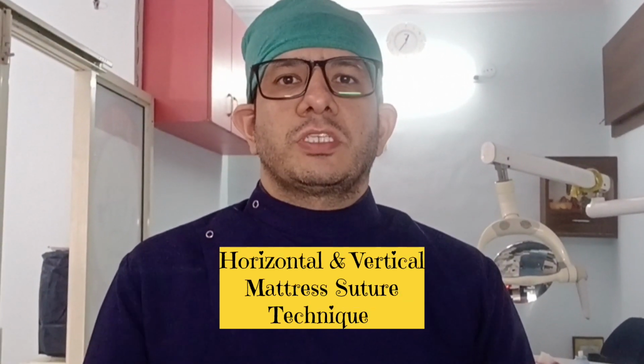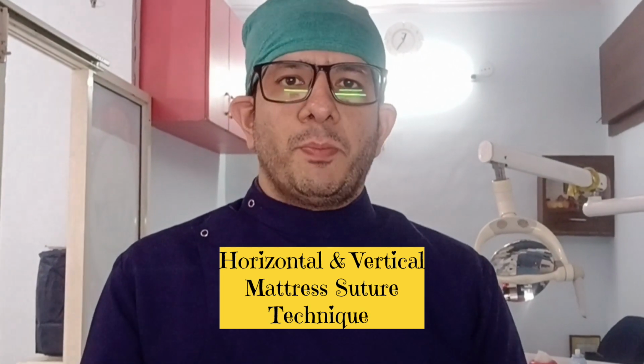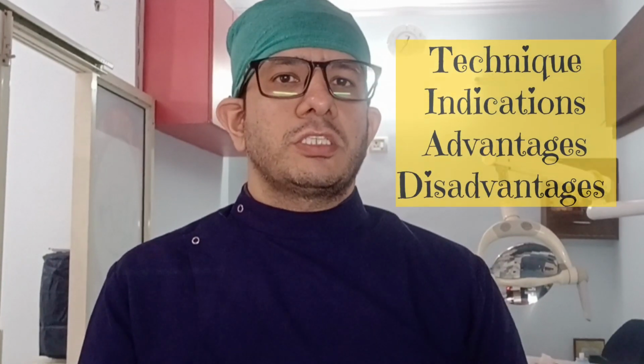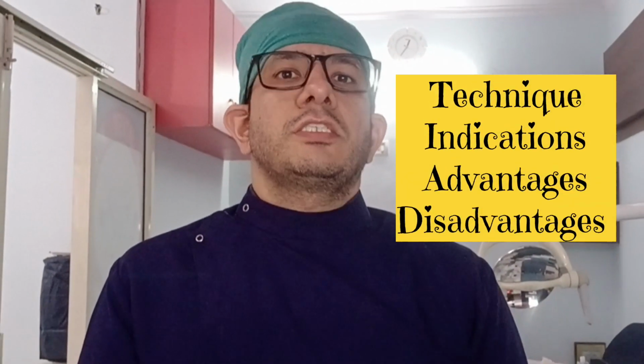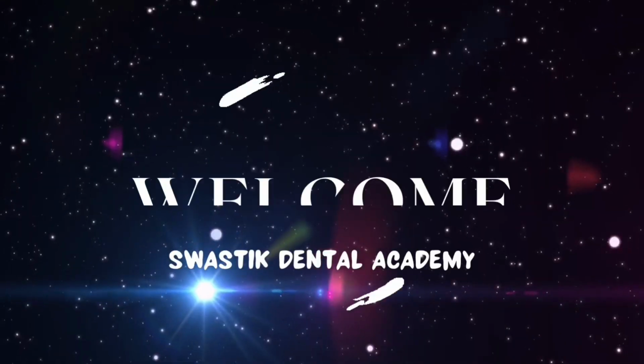So today we are going to discuss horizontal and vertical mattress suture techniques both. First of all, we'll discuss the technique, then we will discuss its indications, then we will discuss advantages and disadvantages. So let's start with this video.